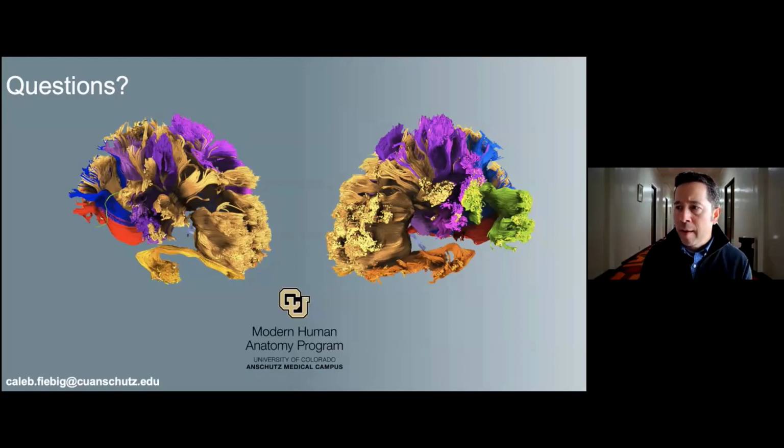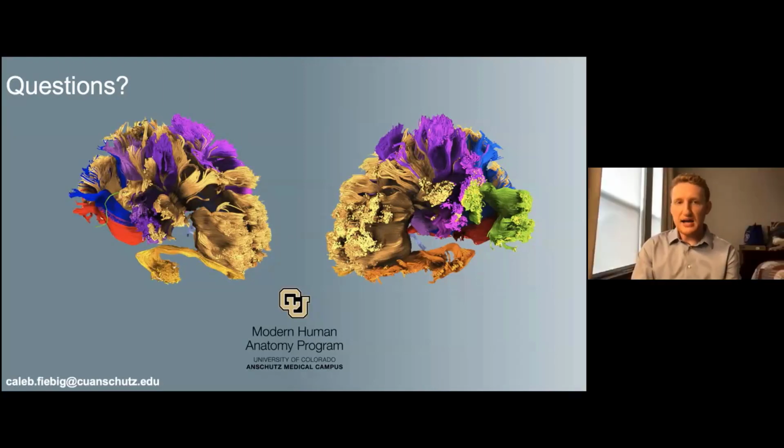There hasn't been a lot of DTI use with epilepsy. Is that true, or is this one of the first studies that people have looked at with epilepsy? Yes, as far as I was able to see in my research, and the main reason for that is that there's not a whole lot of gross anatomical changes that we see in the brain with epilepsy, and so nobody had combined SEEG data along with the DTI white matter tract, and we haven't had a reliable way of measuring these fiber bundles to compare between different fiber bundles.